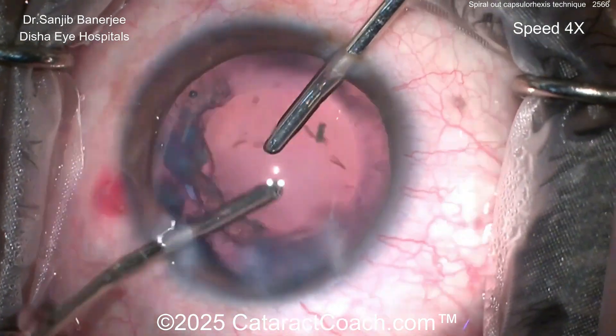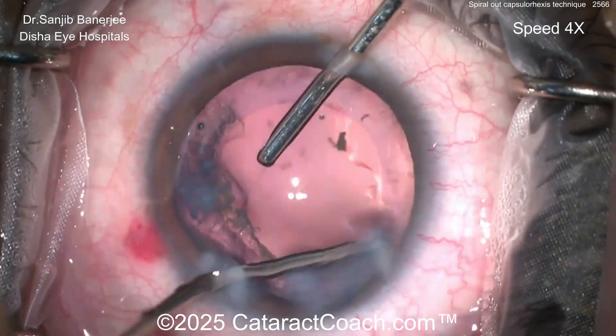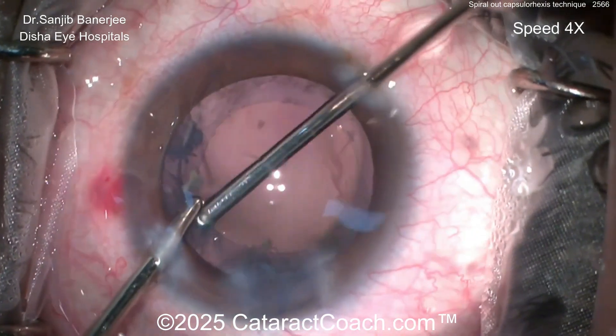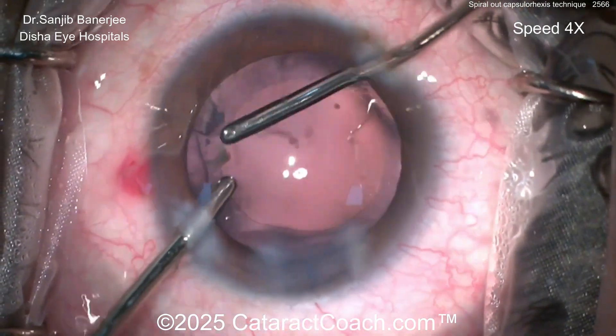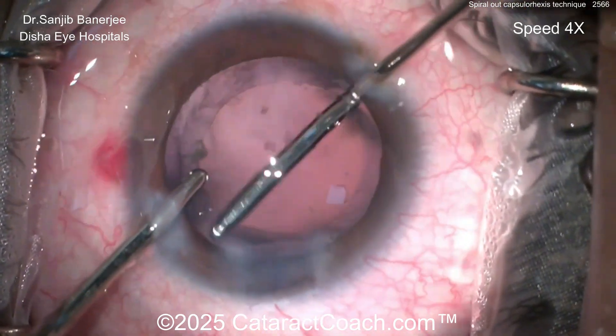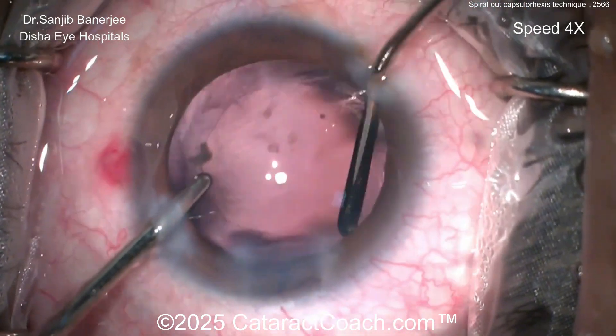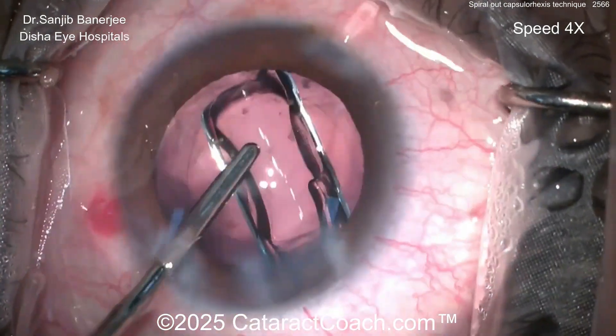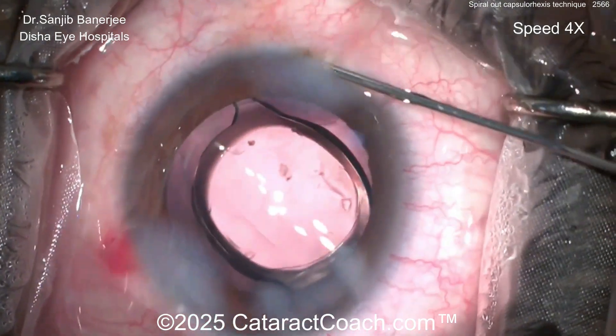The patient is going to be so amazed. The manual approach for the cortex is great too. With these eyes, this is why you still have to learn how to do an A-scan for ultrasound axial length measurements — very important — because with these absolutely opaque white lenses, you can't measure them optically; you need to have that skill set. End of the case, beautifully done.